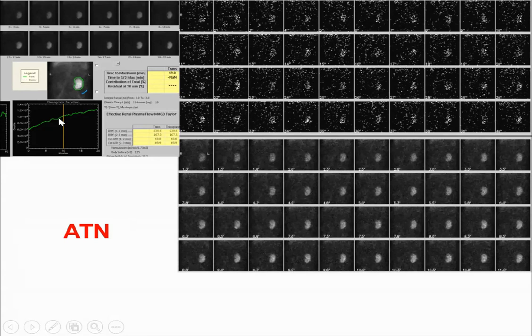It is not obstruction, but there is severe parenchymal retention of tracer leading to this rising curve. These three criteria are also diagnostic for acute tubular necrosis: mildly reduced or preserved perfusion, mild reduction in tracer uptake, and delayed excretion due to severe parenchymal retention of the tracer.